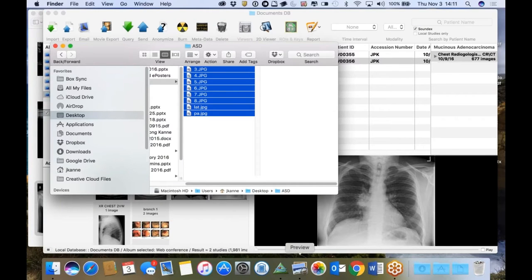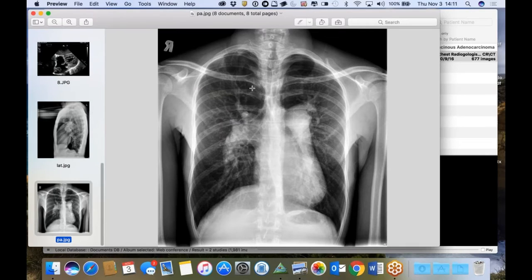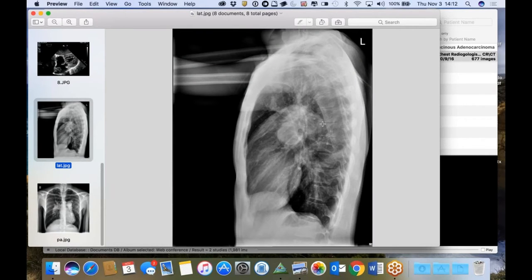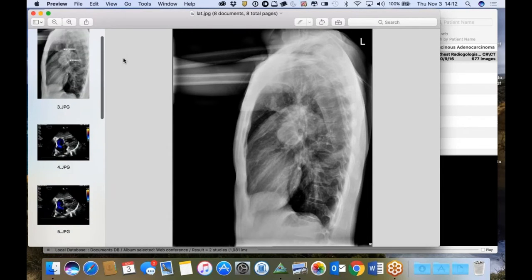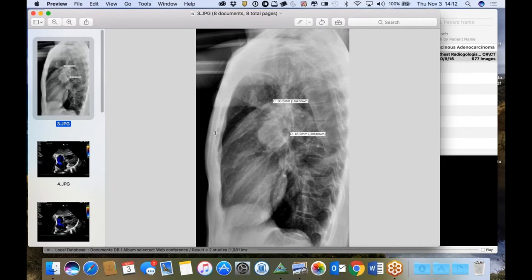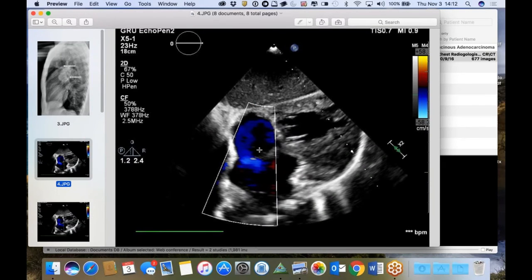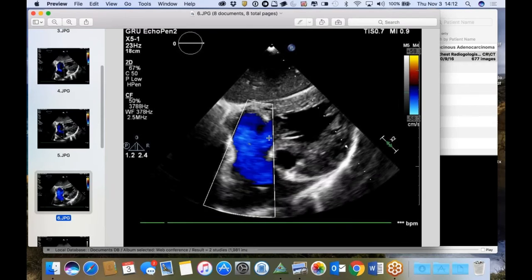This next case was sent from Augusta - a beautiful case of a young patient with huge pulmonary arteries. On the lateral radiograph you can see the dilated right and left pulmonary artery. This patient has an atrial septal defect with Eisenmenger syndrome. The echo images show just how big these are, with measurements confirming they're huge. There's the defect in the atrial septum, and another image shows the reversal of flow - instead of left to right, it's right to left, because we're going away. There's also some RV hypertrophy.